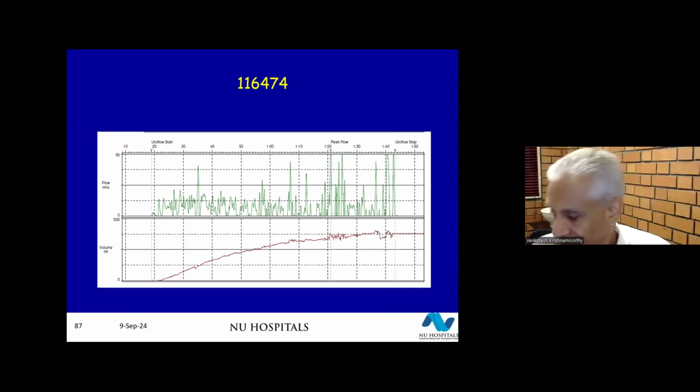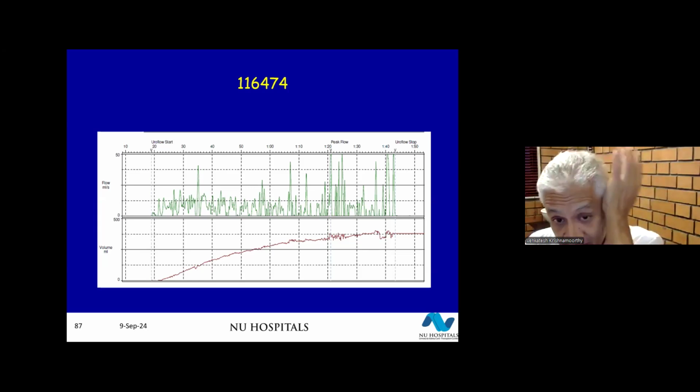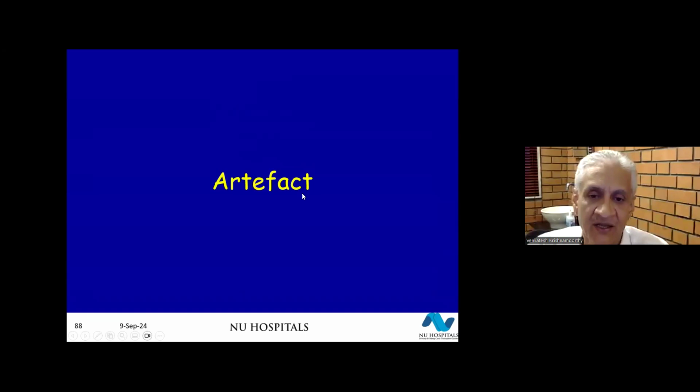So this graph shows multiple peaks, sir, interrupted flow. I told you that the bladder is incapable of contracting, there's no efficient contractions of the bladder, sir. Okay. Anybody else? Shruti? Sir, should we consider a cruising artifact? Cruising artifact. Anyway, basically, this is an artifact.